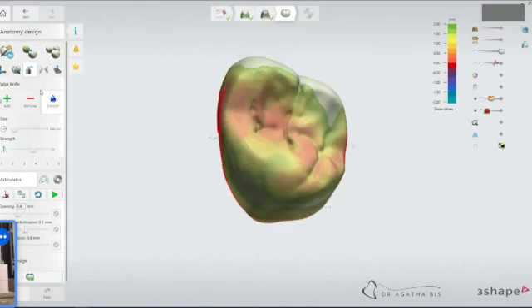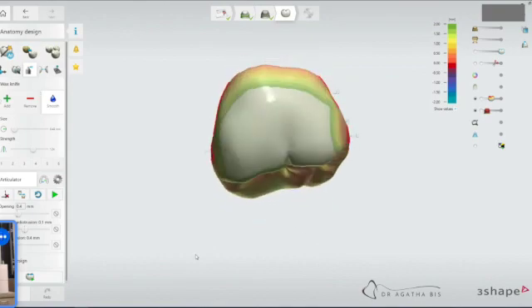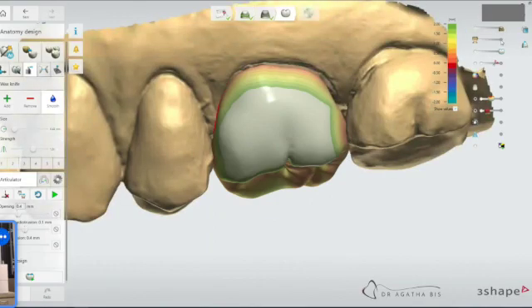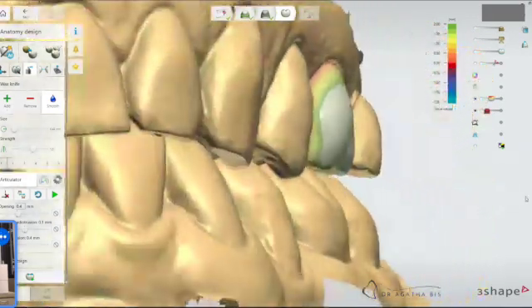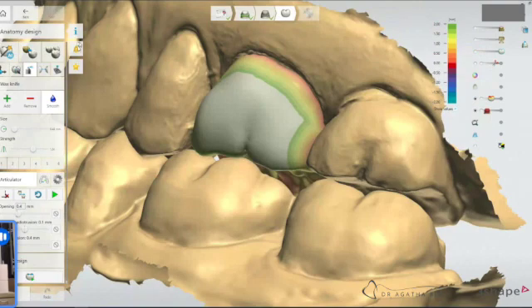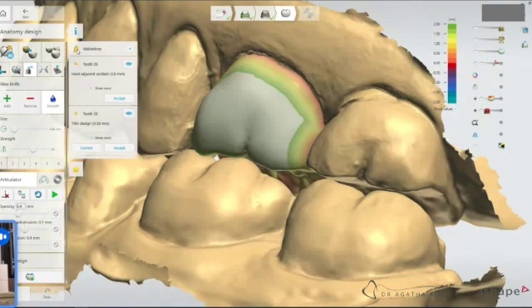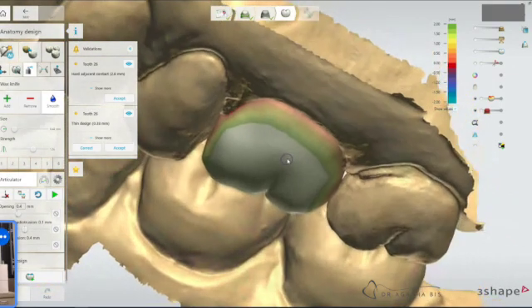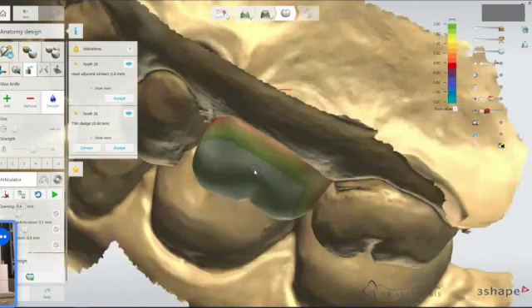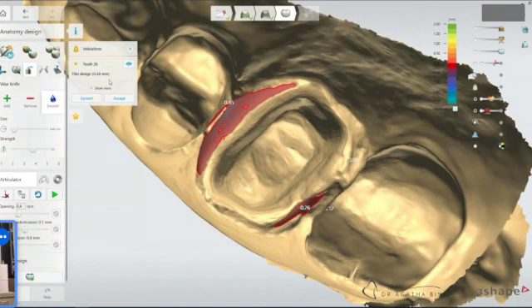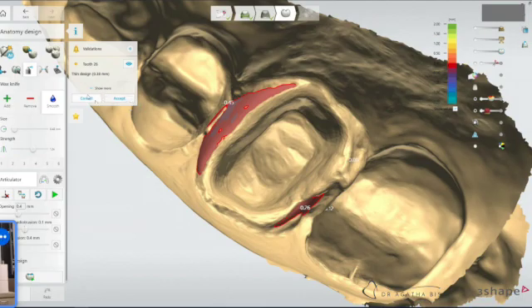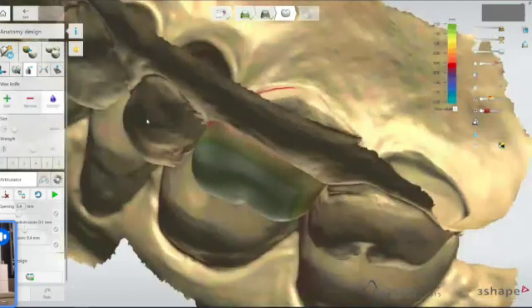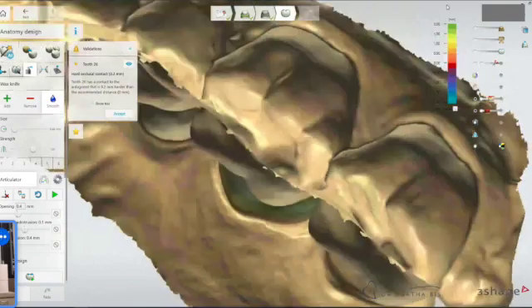And then if you are happy with the design, let's take a look how it looks with the opposing teeth again. Let's say that you're happy. You want to double check and see what's going on here. I did make my adjacent contacts a little bit more. This is measuring tissue so you can accept it. Thin design on the occlusal. If you correct it, then you'll get those interferences back. I'm going to accept it here. But if you let the system correct it, then it'll eliminate that. And then you can essentially just test it in the mouth. Now it's showing that you have a heavy contact. But again, you can always tweak it.